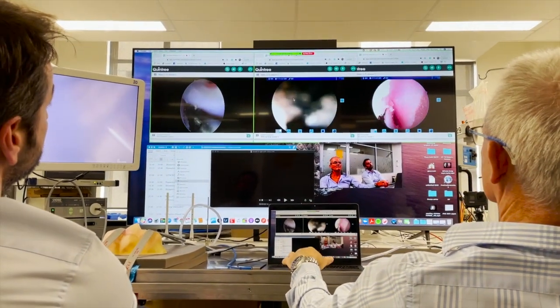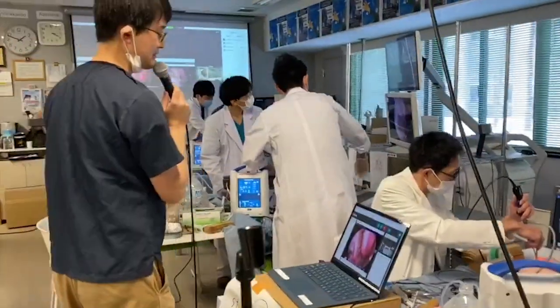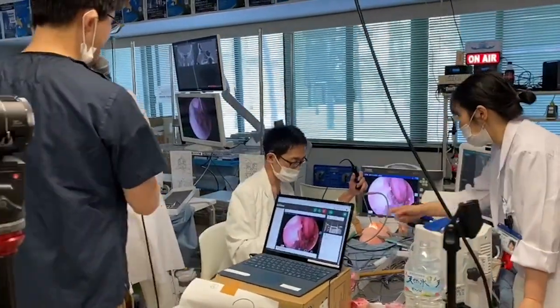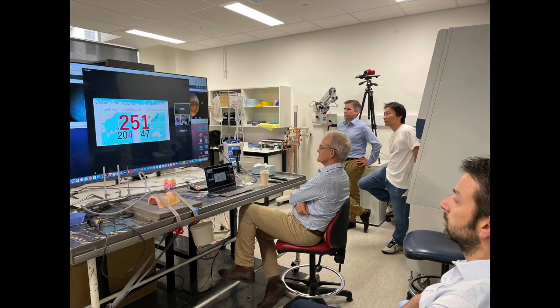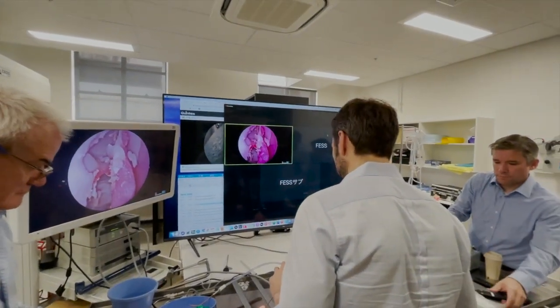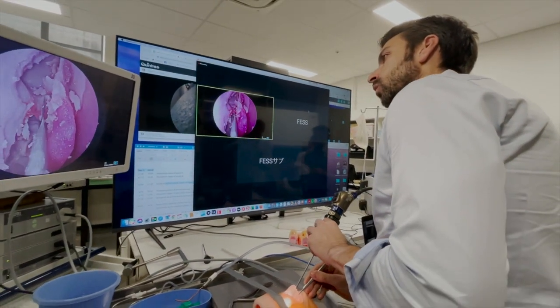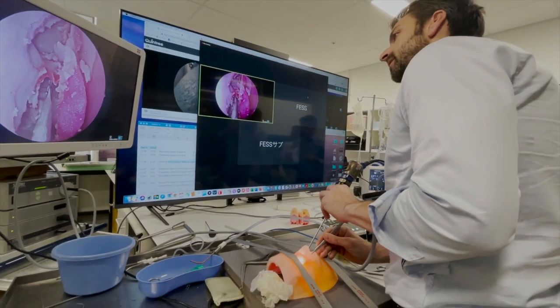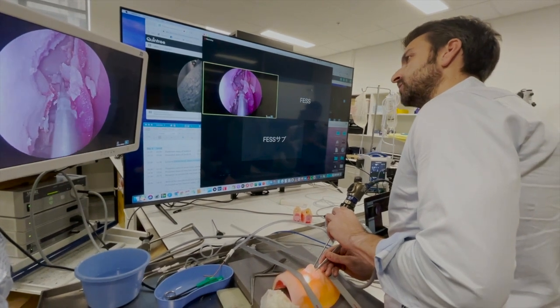Take it up as high as you can and then we'll be able to see our frontal. On completion of each of their dissections, Adelaide then does a dissection demonstration on exactly the same model which each of the delegates have dissected, thereby reinforcing the steps, the anatomy and the procedure.